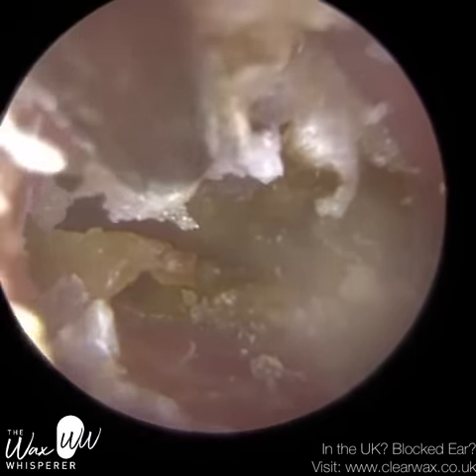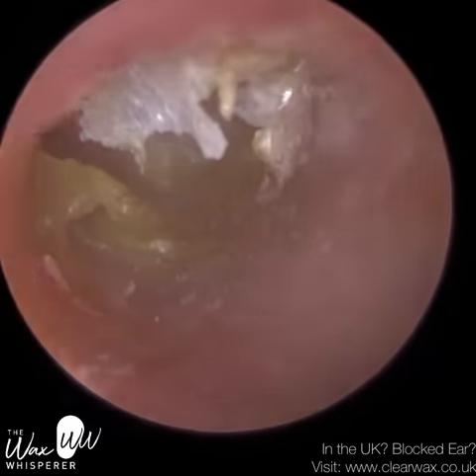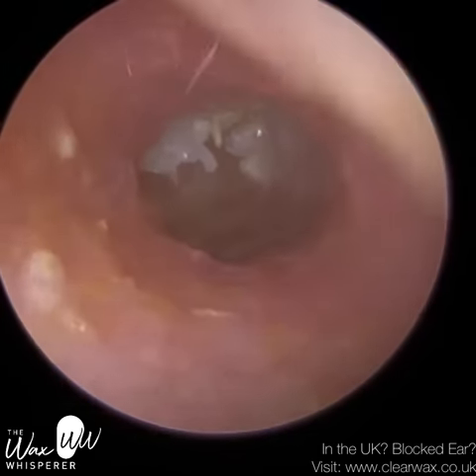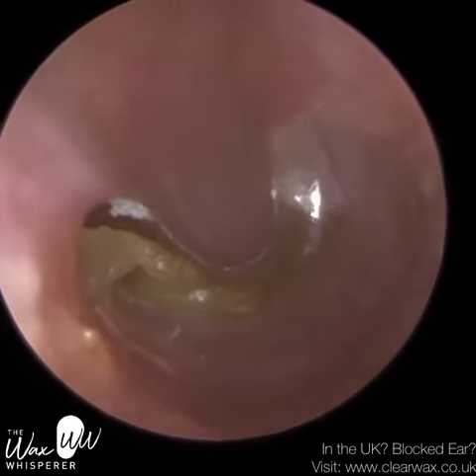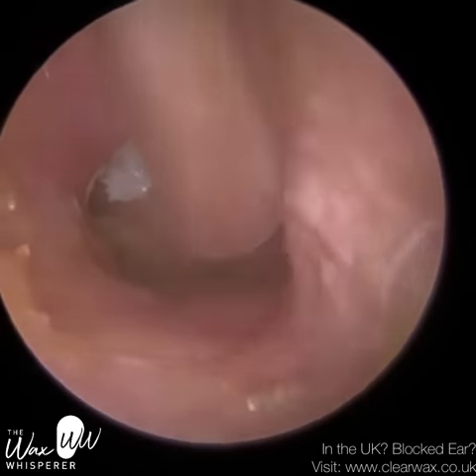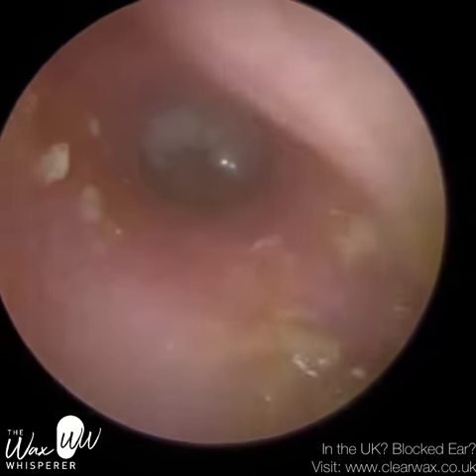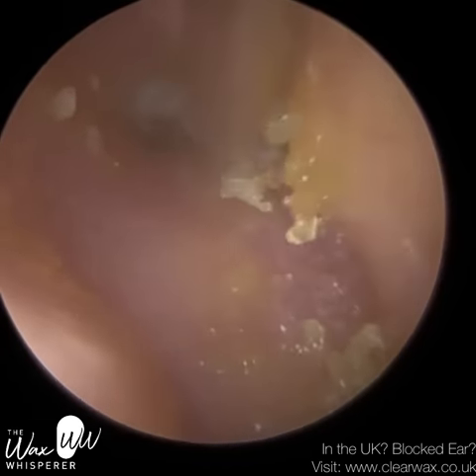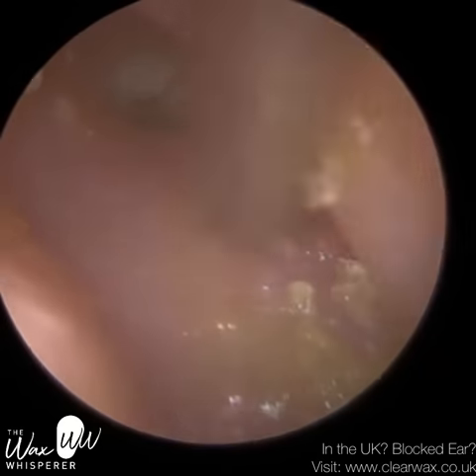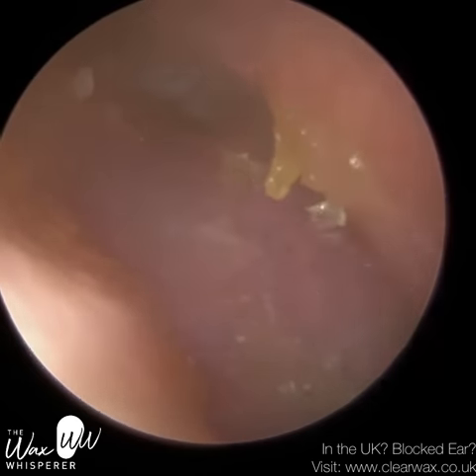I've just put some more drops in and I'm going to let that soak. I'm first trying to remove some of the residual drops. You can see how narrow that mid-canal now is — now that I've come away with the endoscope, you can see the narrowing. When you've got a narrowing like that, it's challenging not only in terms of getting the view but also the manoeuvrability of the instrument in the ear — you've got less space.